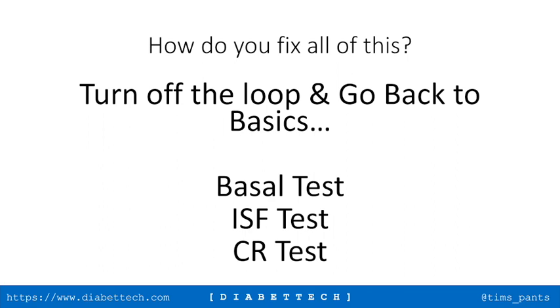If your time in range is 75%, but you're seeing stuff that's higher than you want it to, are you comfortable with that, or do you want to make changes? It's really a very personal decision. If it's not causing you to struggle with hypos, if it's not causing you to have periods where you're uncomfortably high, then ultimately you have to make that call. I'm never going to sit down and tell you that the loop isn't working for you.